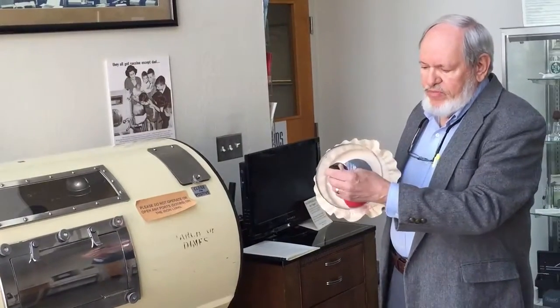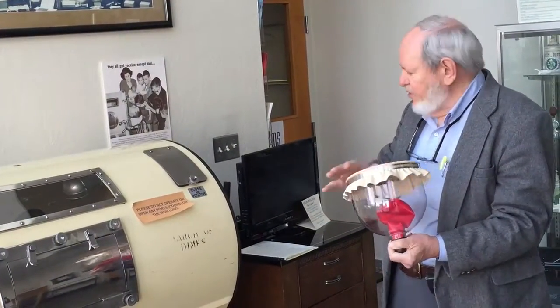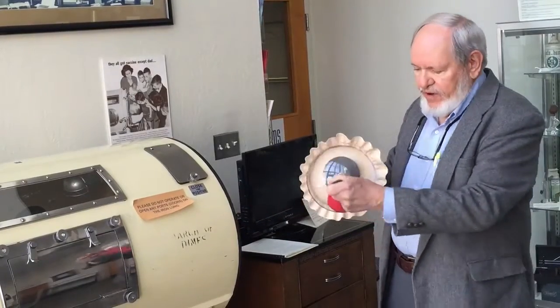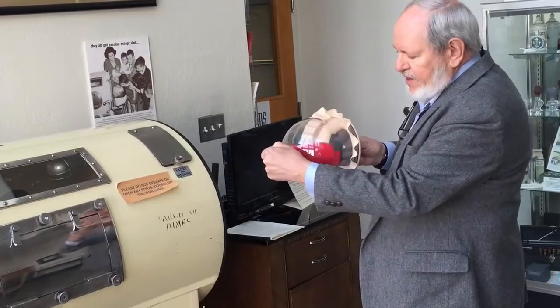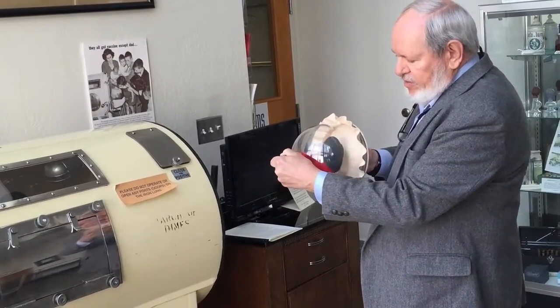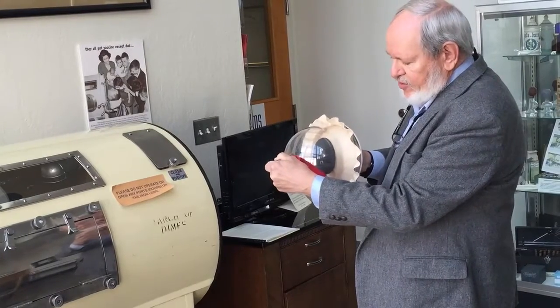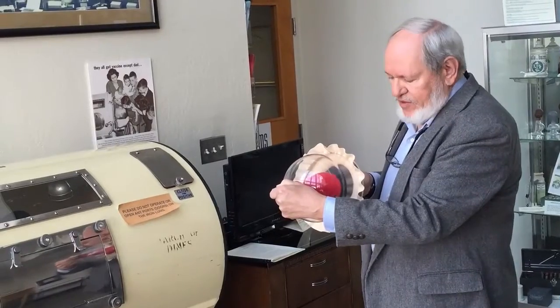The patient's head would be represented by the black knob here. The diaphragm here would be represented by this diaphragm, and the red balloon would be the lungs. So when the diaphragm pulled out, it would put air into the patient's lungs, and it would push air out of the patient's lungs when it went in. That's basically the same way that your own diaphragm and body works.